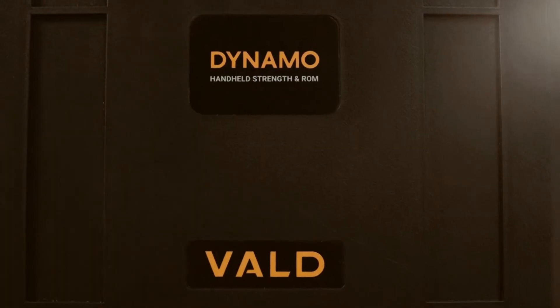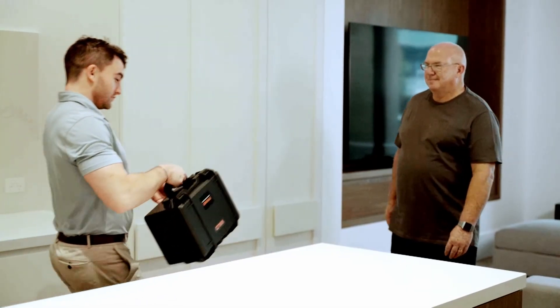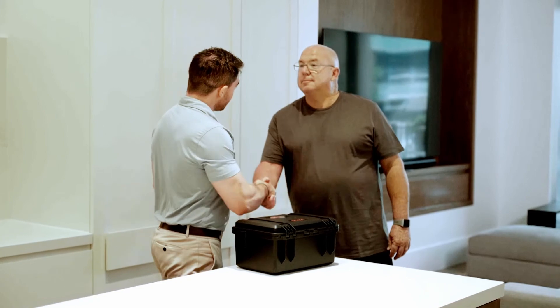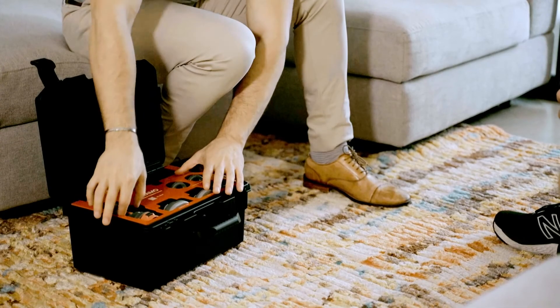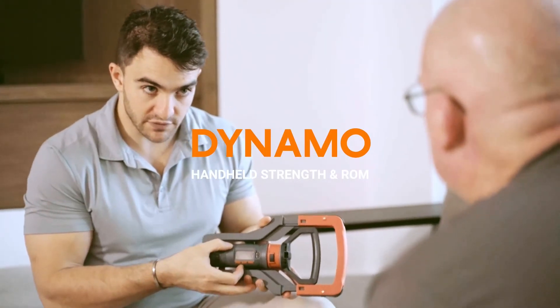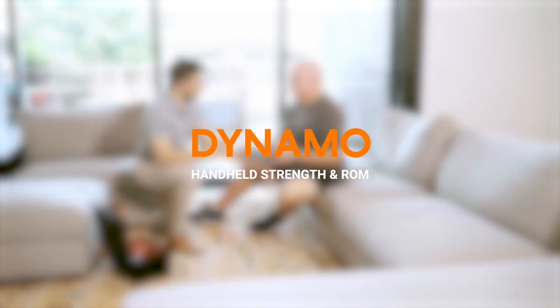For exercise professionals on the move, Dynamo's travel case fits everything you need to take your testing on the road. It's the next generation dynamometer and inclinometer in the palm of your hand. Introducing Dynamo, the handheld testing system for the modern exercise professional. From VALD.